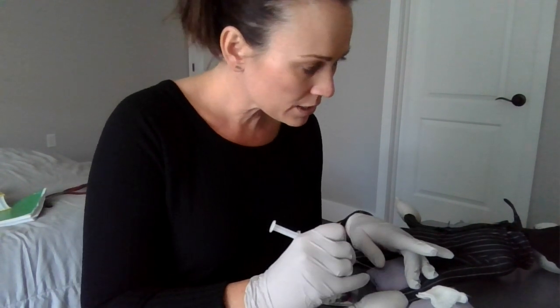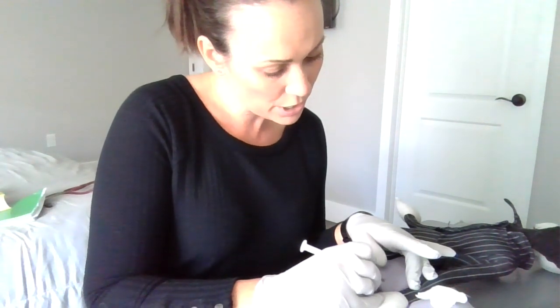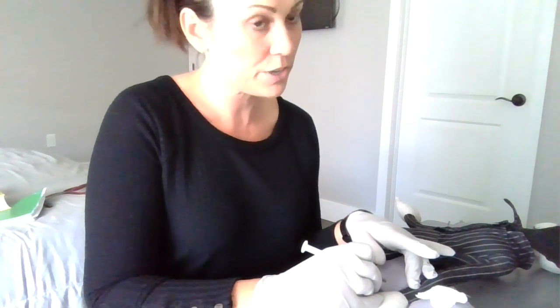I'm going to go ahead and explain to the patient that I'm going to insert on the count of three — one, two, three. Needle's inserted. I'm going to wait for the blood to fill up the syringe here.